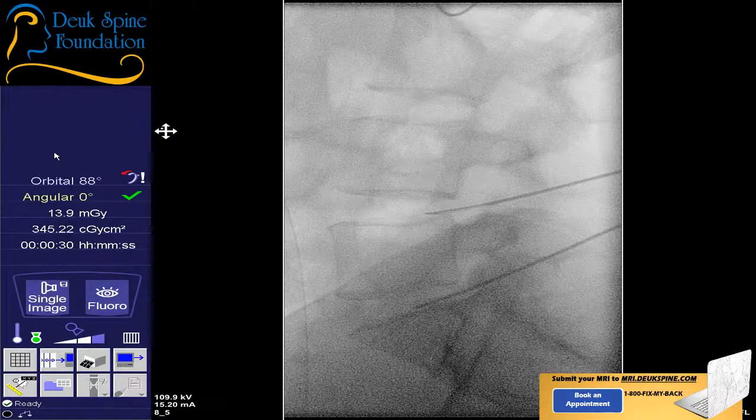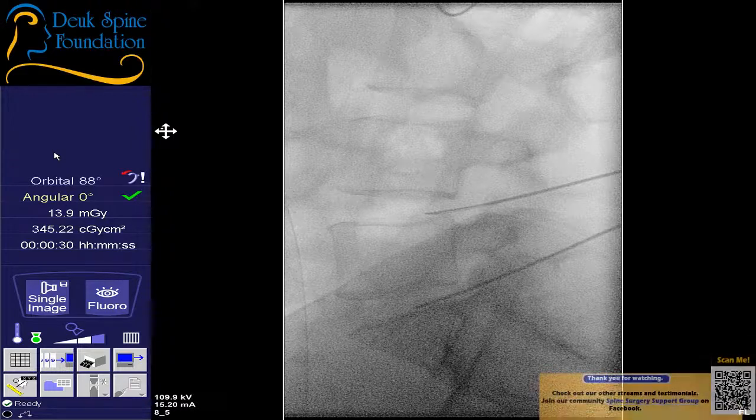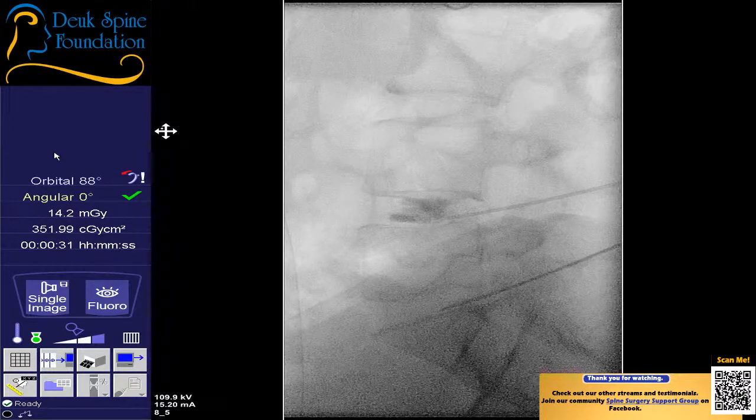Do you normally get back pain? Yeah. I couldn't understand what she said. You do normally get back pain, right? Yeah, I said if I woke up without it, I'd probably think I was dead. Okay. Is that your typical back pain? Is that where you typically get it? Yeah. How bad is that on a scale of 1 to 10? 10? So L4-5 is a 10. Concordant.